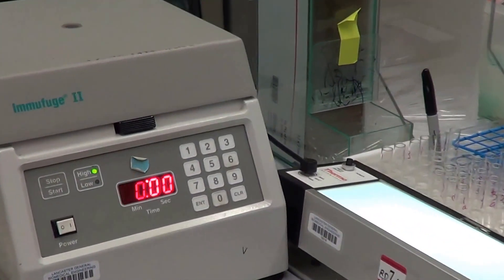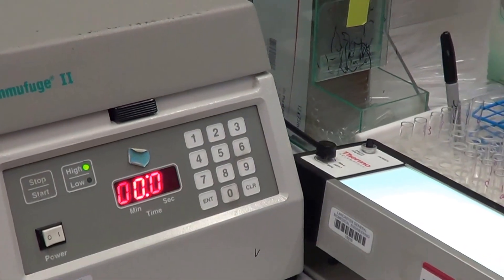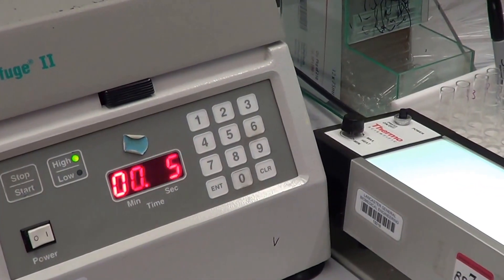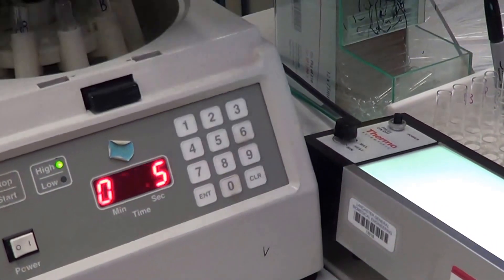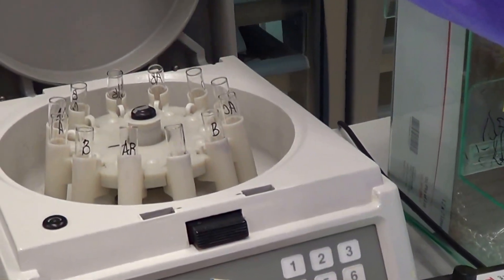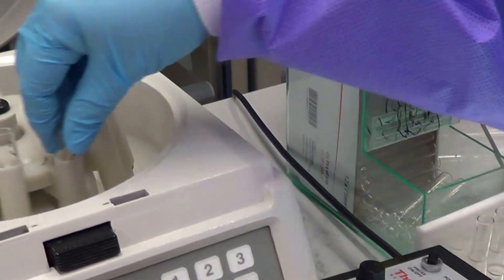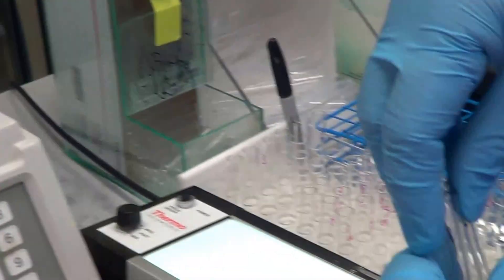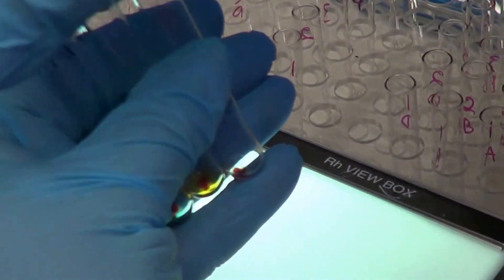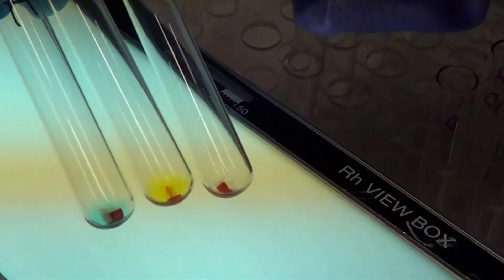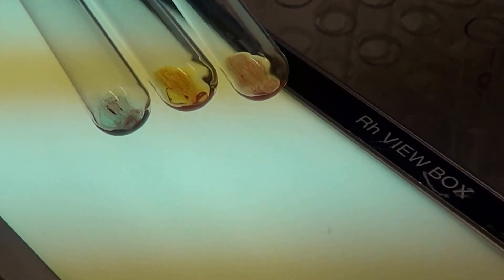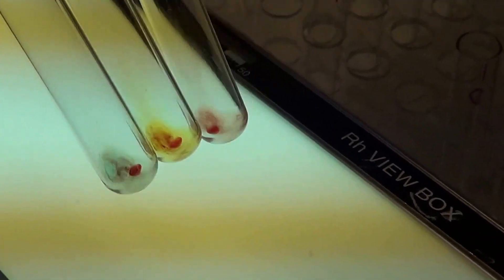After the centrifuge is completed, you remove your tubes and hold them over the light. You gently rock and shake your test tubes, looking for agglutination.